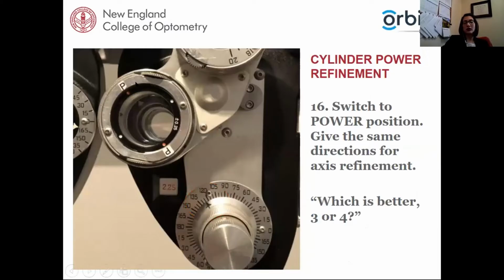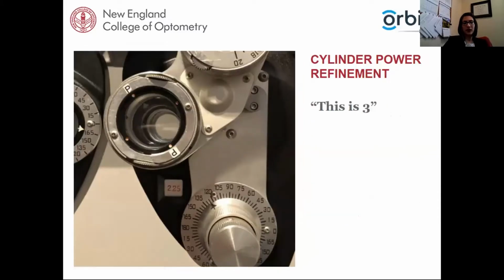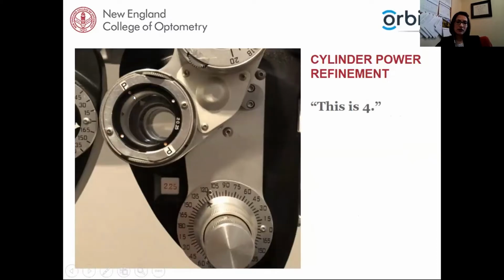And so we switched the JCC into power position, which is when the red and white dots line up with the arrow. And again, it doesn't matter if you start with the red dots or the white dots lined up with the arrow, because as you change the options 3 or 4, 1 or 2, those dots swap. But you do want to make sure that one set of those dots are lined up with the arrow to start. So this is option 3. You can see that the white dots are lined up with the arrows, and this is 4. Now the red dots are lined up with the arrows.